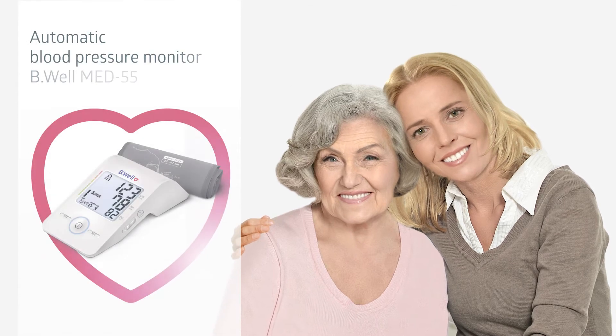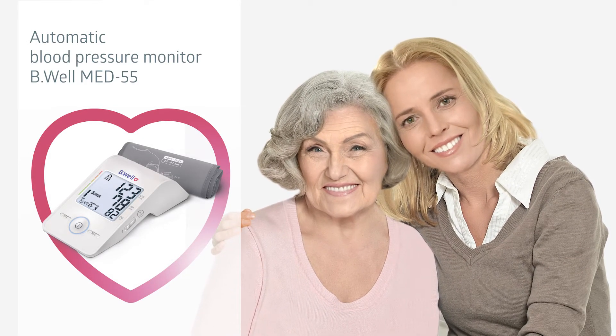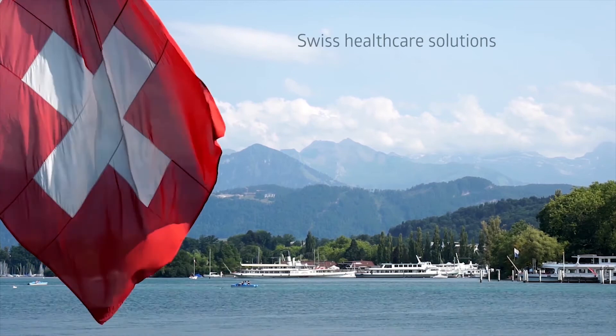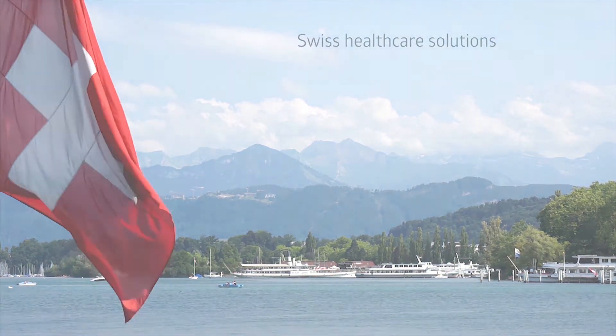Be Well — caring for everyone. Be Well Med55 Automatic Blood Pressure Monitor. Intelligent measurement with a unique 3-check technology. Created in Switzerland, the Med55 Blood Pressure Monitor offers professional accuracy and complies with high European quality standards.